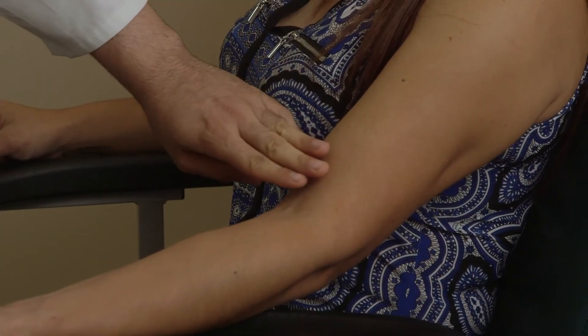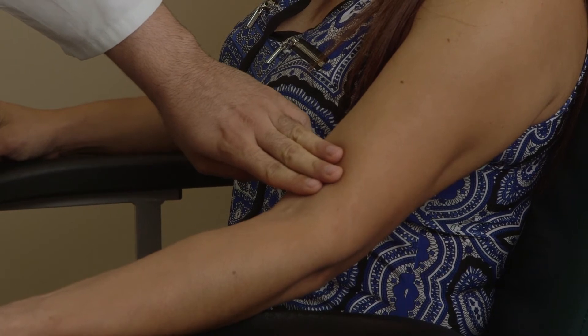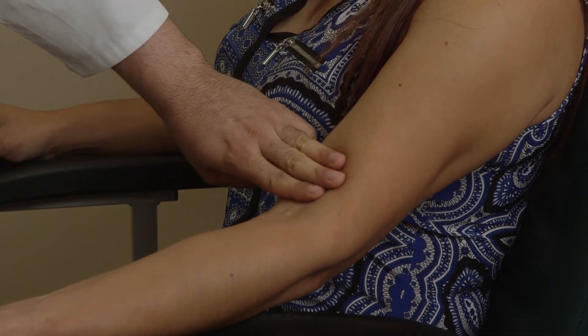Hello, my name is Omar. I'm from the lab. I'm here to draw your blood. Can you please tell me your name and date of birth? Isabella Hernandez, July 28, 1986. So Isabella, what we're going to do is check your arm. Do you have an arm preference where you usually get your blood drawn? This one. Okay, so we're going to check your veins to see which one is the best one. It's usually three to four fingers above the crux of the elbow.